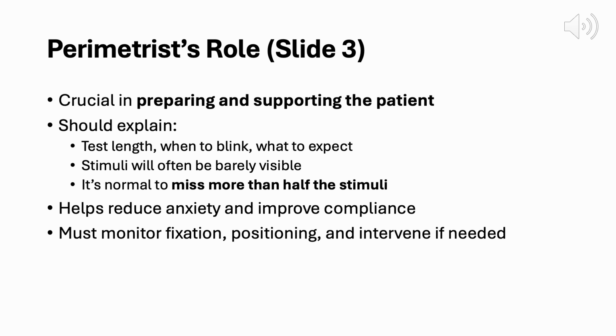The perimetrist plays a critical role in preparing and supporting the patient before and during visual field testing. Their guidance directly influences test quality. Before the test begins, they should clearly explain what the patient can expect, how long the test will last, when it's okay to blink, and how to respond to the stimuli.